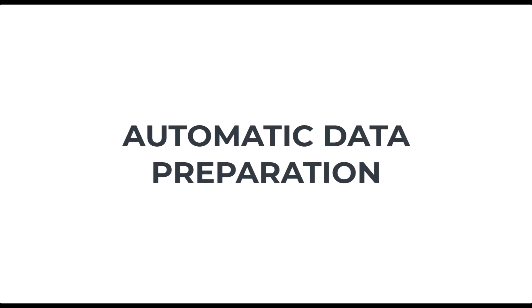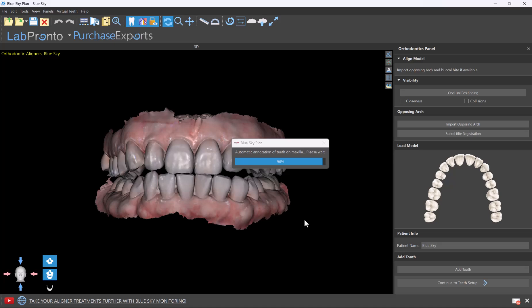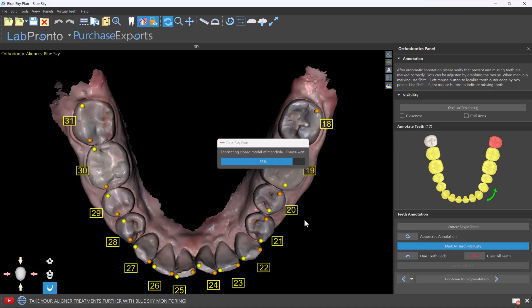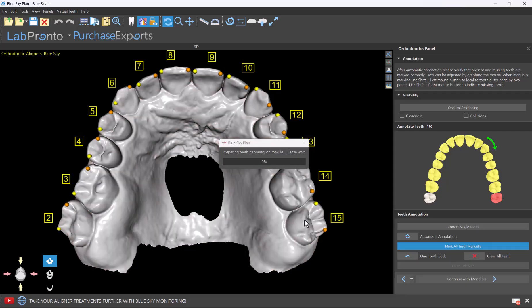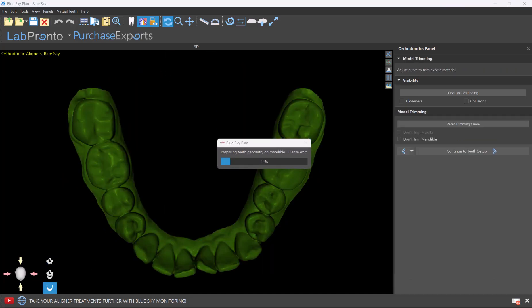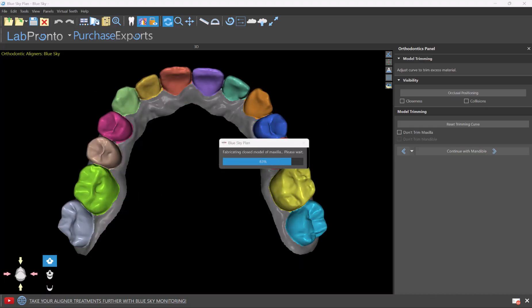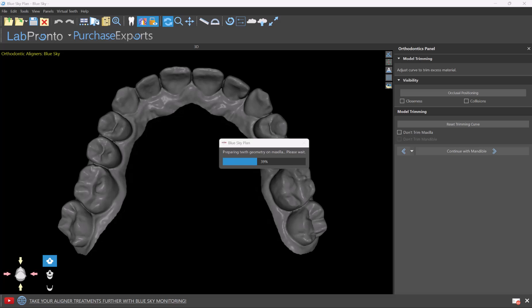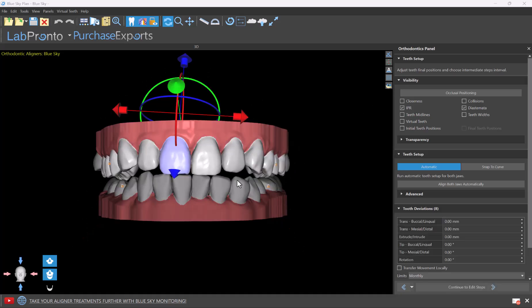First is automatic data preparation. I've selected the relevant optical scans to import. I know there are those that do automatic segmentation or automatic alignment, but we are running automatically through all the data preparation steps. We're aligning the models in space automatically, annotating automatically, segmenting automatically, and cleaning up the models automatically. We're going through all of the data preparation steps straight from import to the point where you could treatment plan. Completely automatically.